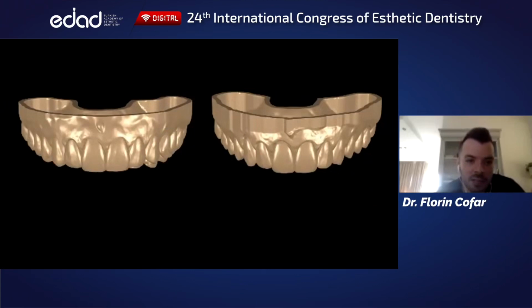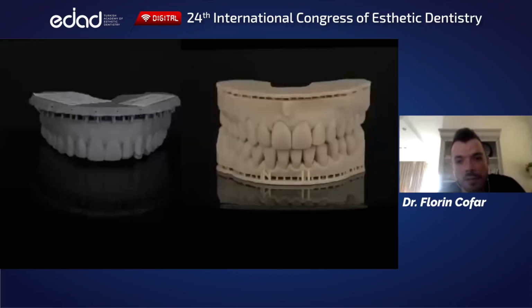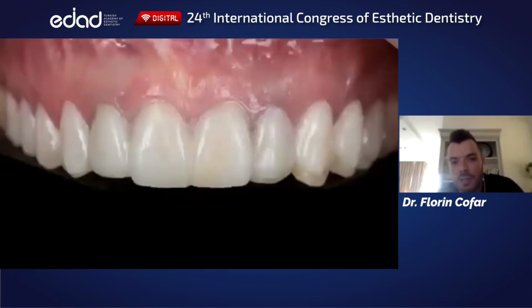And in this case, just to make sure, because I need to do some corrections, I also asked them to make me the same version, but in the motivational form, where they move the library slightly in front. The reason why I need to do that is because I need to just check. It's been like 1.5 years of treatment, so I need to make sure that everything's okay.